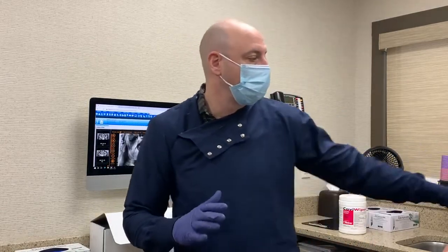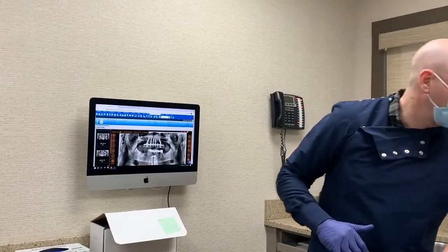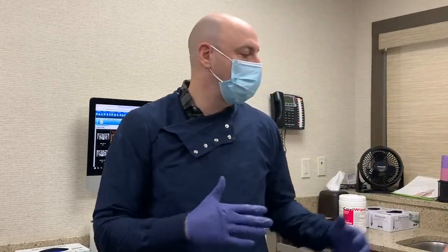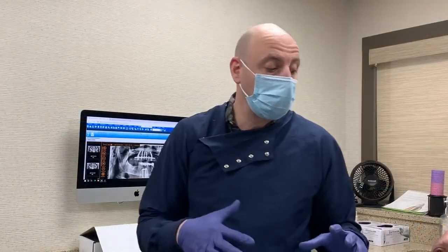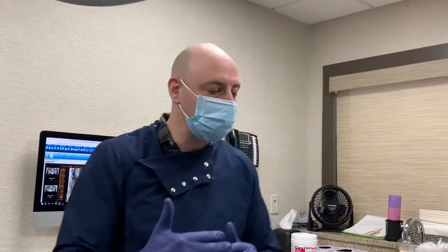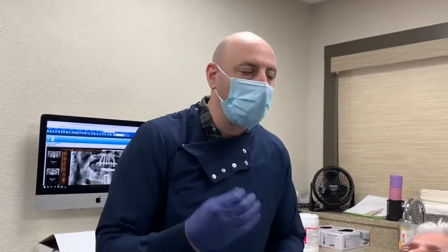I advocate for a try-in because some practitioners will go straight from the duplicate prosthesis and go right to the definitive restoration. I always need to do a try-in to confirm where we are and to have the patient sign off on it. So I like to always do a wax tooth try-in. And if you don't like the position of the teeth, or if our occlusion is slightly off, like we just saw right now with Jack, I can make an occlusal adjustment on the denture setup. If we're vastly off, if we don't like the midline, if it's canted, if there's anything that's off, the patient doesn't like it, all we got to do is take a hot spatula and move the teeth into position.